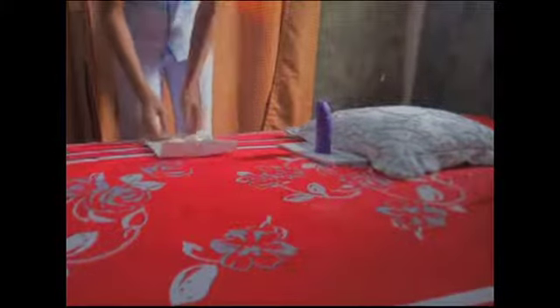To start the procedure, we will wear our sterile gloves to maintain sterility. We don the gloves — first for our dominant hand, then for our non-dominant hand. After that, we pinch and expose at the sterile field, making sure we are not touching anything unsterile after wearing our gloves.